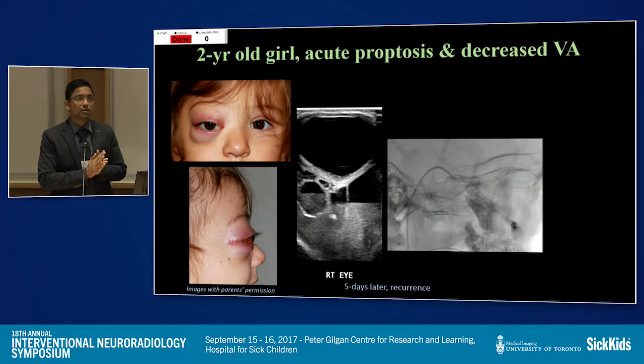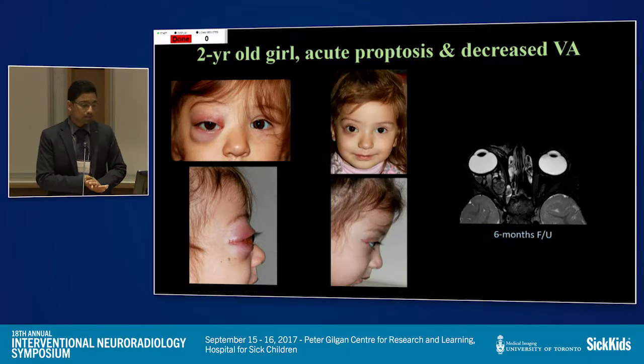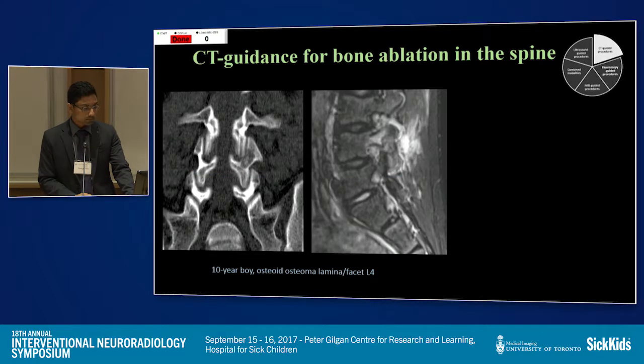We did sclerotherapy with bleomycin. A 5 French drain left in place allows you 2 or 3 sessions as required. She had an excellent outcome. This is her 6 months out. She has only the telltale sign of the lateral canthotomy, but little else. In most of these cases, you still see some residual disease on the MRI. You can also see some optic nerve buckling, but she has remained asymptomatic without recurrence.